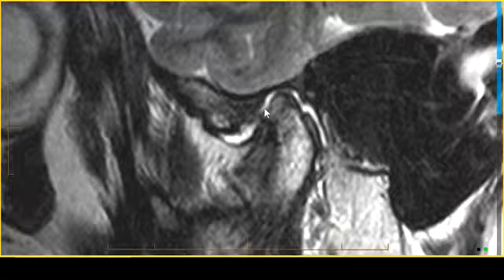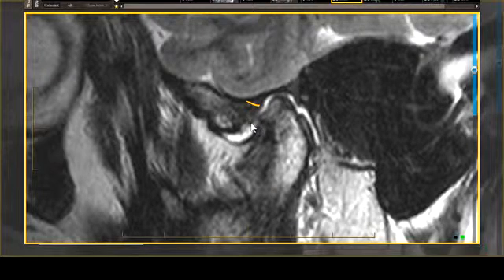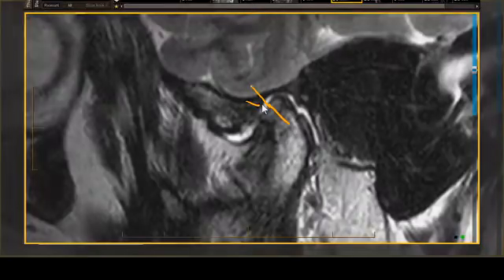So if we assume that this is the back of the posterior band, front, back, this is our anteverted condyle, this would be 12 o'clock, and we'd say, okay, there is our 12 o'clock position. So our meniscus is maybe 30 degrees off the 12 o'clock position. Really not that bad. So the American Dental Association criteria of grading closed mouth subluxation, not really that effective in telling you what's going on in a case like this.